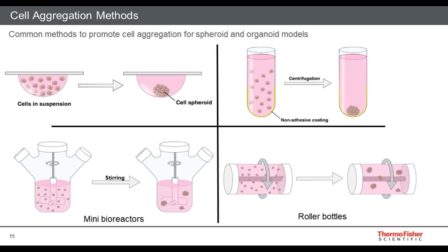Some of the reasons why this is done is that while it may help improve spheroid formation as well as consistency in the size of the spheroid, the agitation is also thought to help better feed some of these spheroids. So it helps mitigate the effect of growing too large and forming necrotic cores, which may not be desirable for many cell models. It provides advantages there. And somewhat comparable to that, although less commonly seen, would be the use of roller bottle cultures, which would effectively be doing the same thing, but is probably a less common approach in the literature from what I've seen.